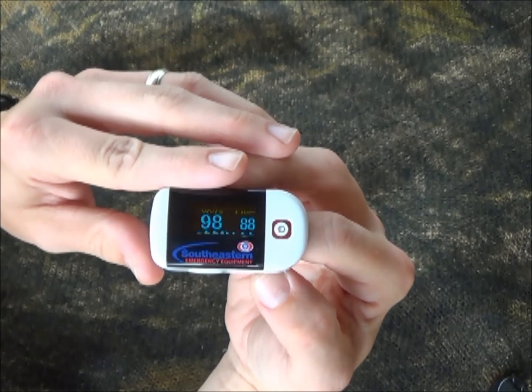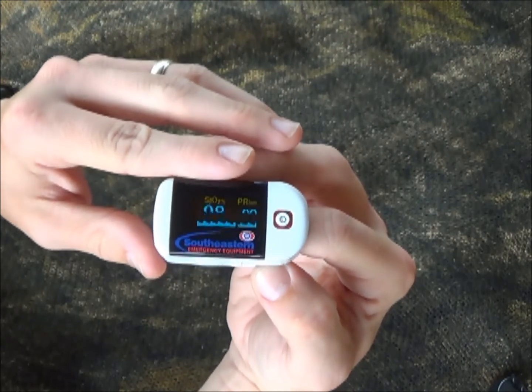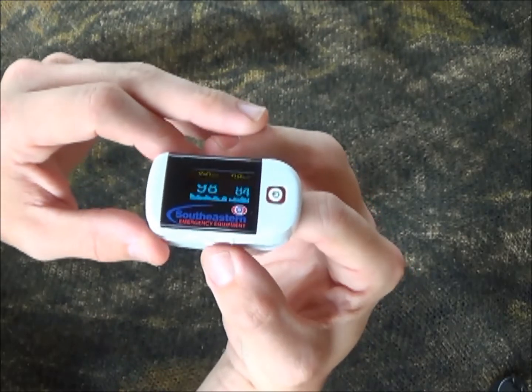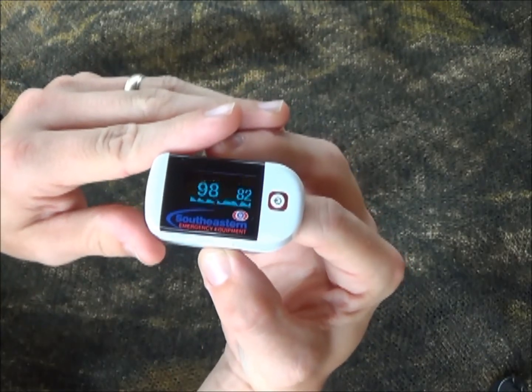There are a few times when this will give an inaccurate reading. If the patient's hands are cold, it gives an inaccurate reading. If they have dark fingernail polish on, it'll give an inaccurate reading. If they're in shock, meaning that they're not perfusing very well, this will also give an inaccurate reading.